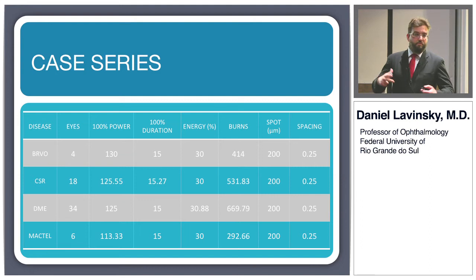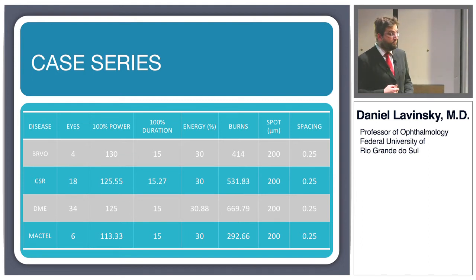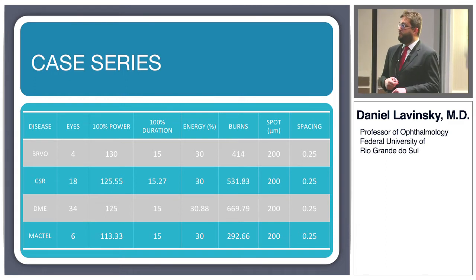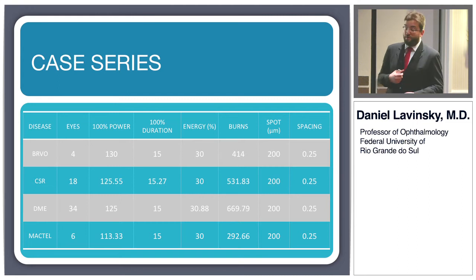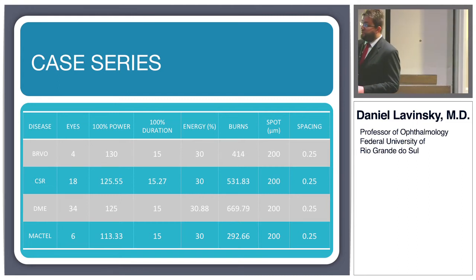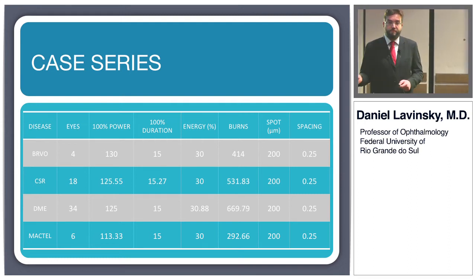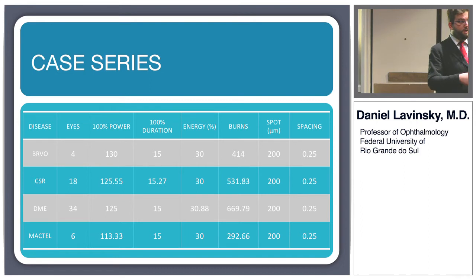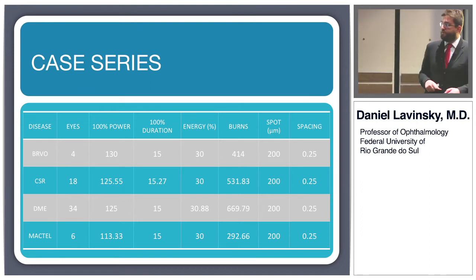DME is really the largest number of cases that we have. In Brazil, the insurance companies still don't pay for Lucentis, for anti-VEGF treatment, so there are a lot of patients who can't afford injections, so we do a lot of photocoagulation, laser treatments, and we also believe that we should combine treatments, either photostimulation or photocoagulation, with anti-VEGF treatment. But that is a different part of the story.